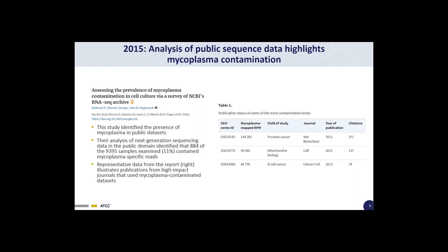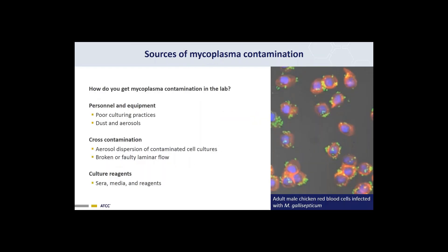Representative data from the report illustrates publications from high-impact journals that used mycoplasma-contaminated datasets. Some of these journals have been cited over 100 times and include Nature Biotechnology, Cell, and Cancer Cell. Turning to common sources of mycoplasma contamination: one of the most common ways is through personnel and equipment, resulting from poor culture practices as well as dust and aerosols. Cross-contamination is also a contributor — for example, aerosols from contaminated cell cultures or a broken laminar flow hood. Cell culture reagents such as sera, media, and reagents can also contribute.